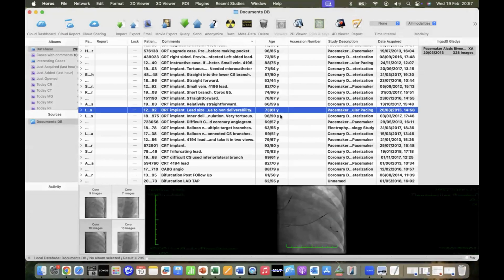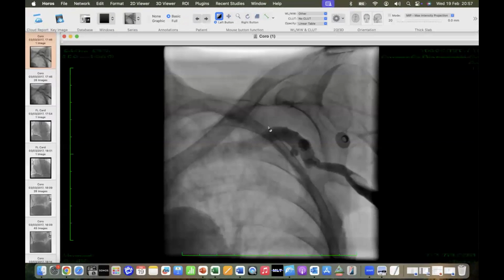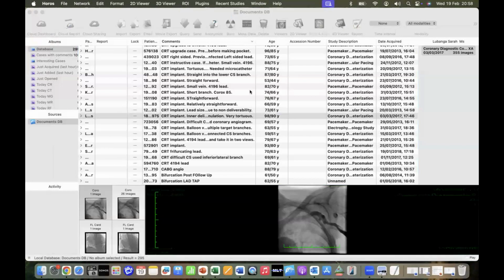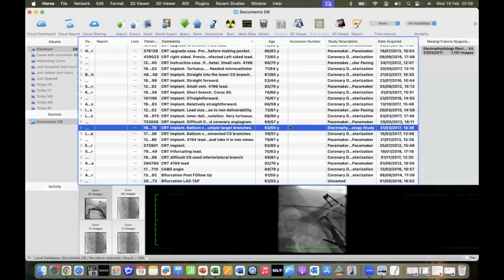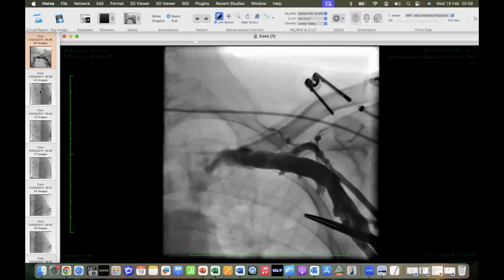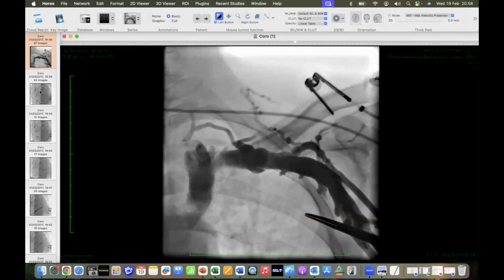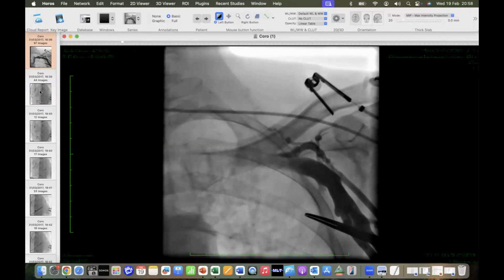One thing I was going to say in terms of the guide delivery system, the Medtronic kit is quite soft. So it's a little bit easier to sort of negotiate tortuosities if you're going telescopically. The Abbott kit, for example, is a braided sheath, and that sometimes can hinder your progress into the coronary sinus. So you may have to think about using a sub-selector in that view.